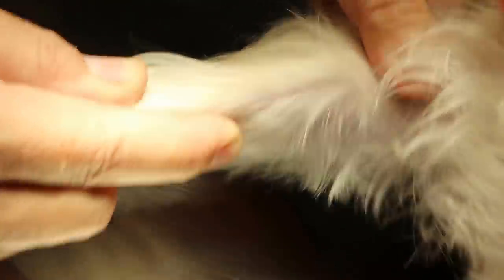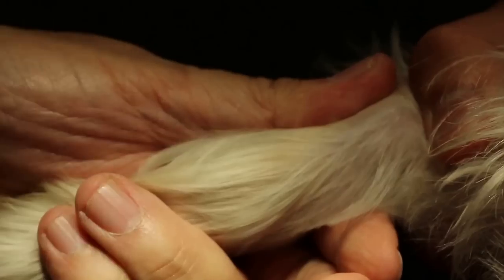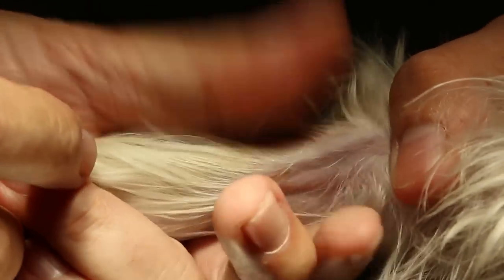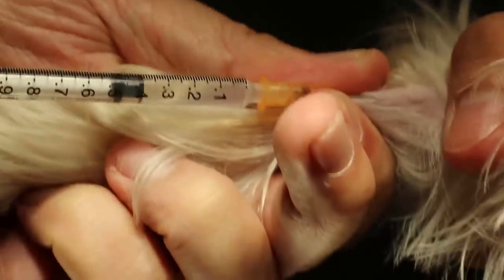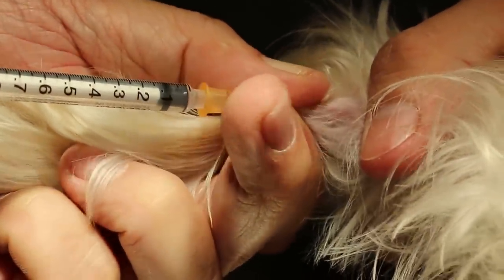Normally the assistant holds behind the elbow and presses here so that the vein is quite obvious. The assistant is good — this vein won't be moving because of this thumb fixed onto it. I'll give a slight sedation: Dormitor plus ketamine, 0.04 plus 0.04. Okay, IV in. Press it so that it won't bleed. Let go already — I expect the dog will sleep within one minute.